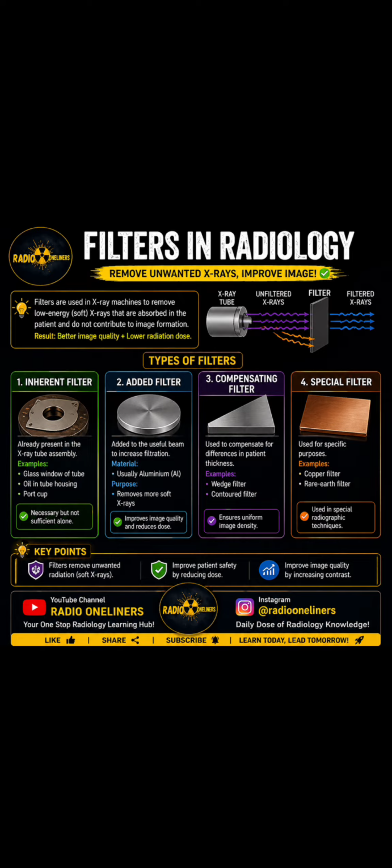Let's imagine that you are taking an X-ray of a patient. A patient comes to the department, and instead of just showing the image you need, all those extra X-rays go to the patient. Now this is not ideal, this is not what we want, right? So filters solve this by blocking all these unwanted rays, and also improve the quality of the image.